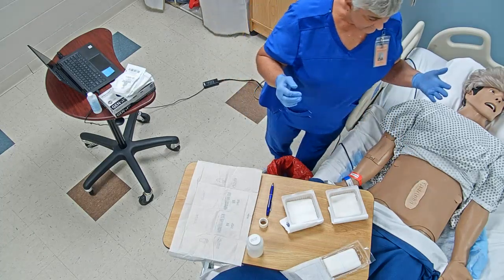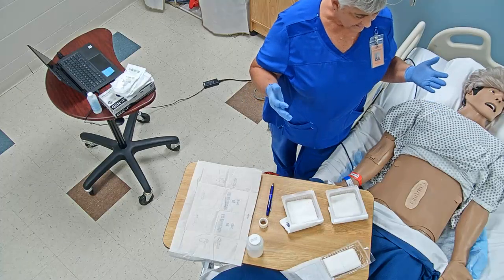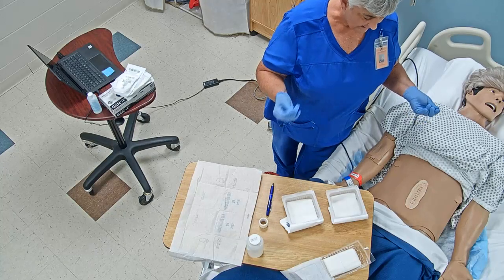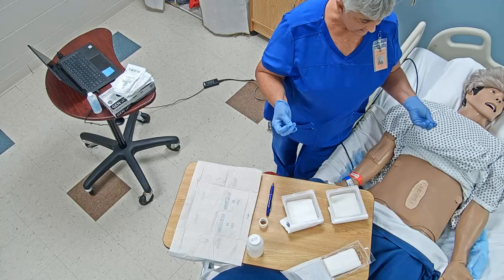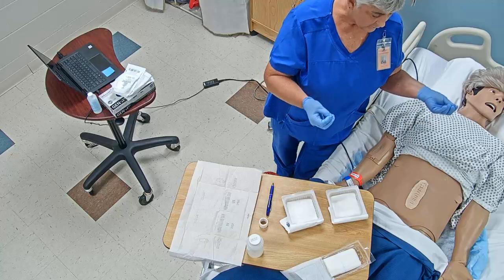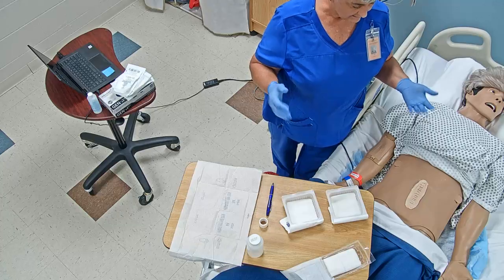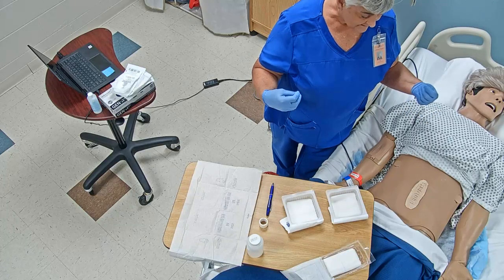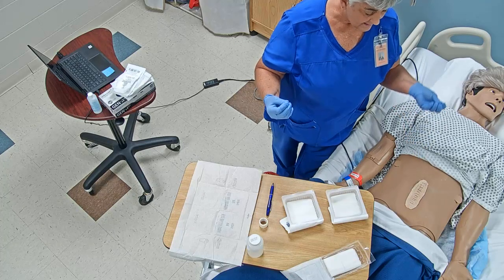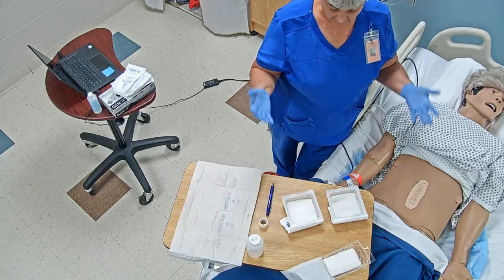Okay. Now that I've cleaned and dried, if the order had asked for a culture, this is when we would get the culture, whether aerobic or anaerobic. We would get the culture now. And let's say that when we were looking at it, there was a little red spot up here. That's where we would want to do the culture, and then we would get the culture. But there wasn't an order at this point for a culture. But as the person that's doing this, if I saw that, I'm going to report that so the doctor can order to get a culture if that's the case.